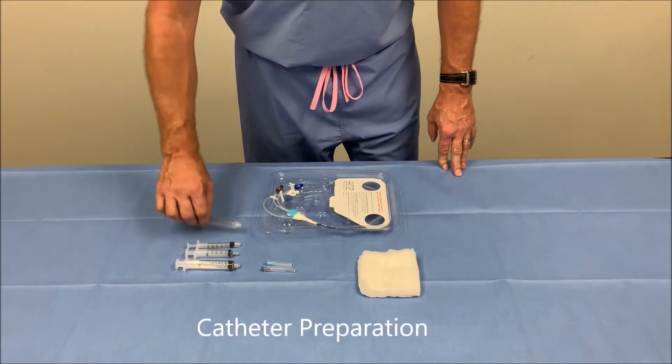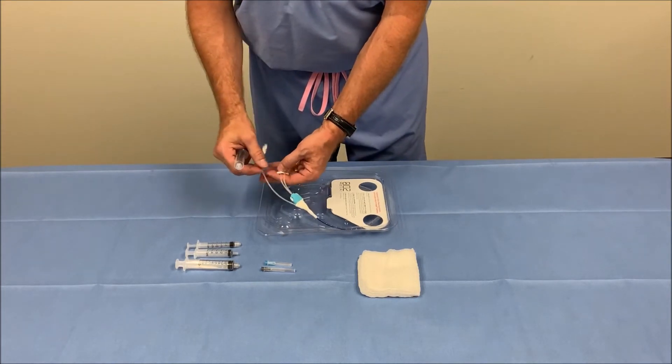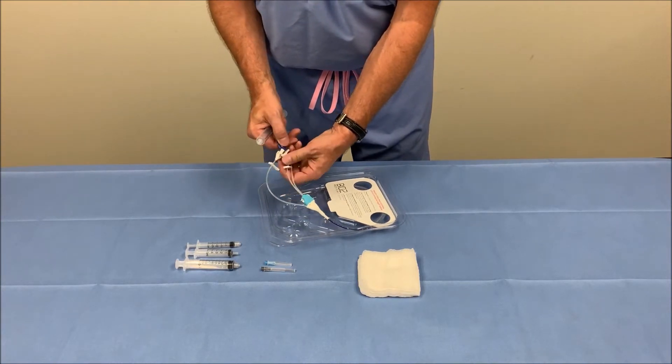The first step is to prepare the catheter. We're going to take a standard saline flush and flush each of the lumens with approximately two cc's, flushing the white port and clamping, flushing the blue port and clamping.